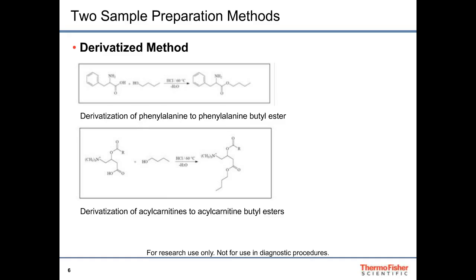They have both positive and negative charges that sort of cancel each other out, typically at pH values from 4 to 8. If we lower the pH enough, we can protonate the carboxylic acid moiety of these molecules to make them positively charged.